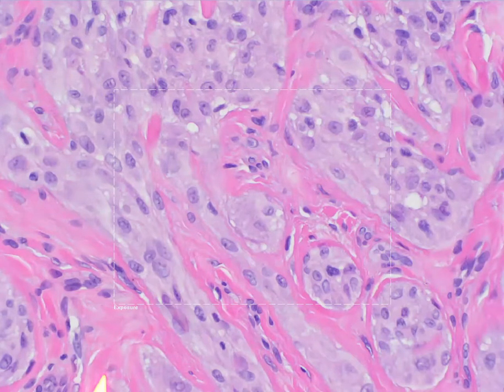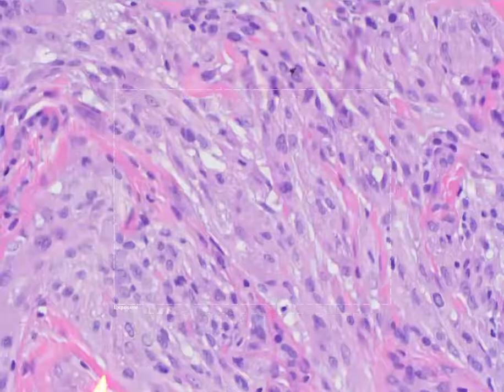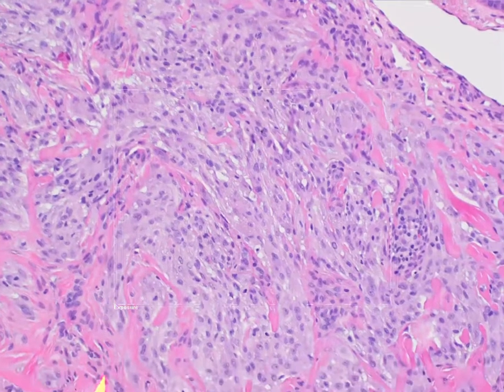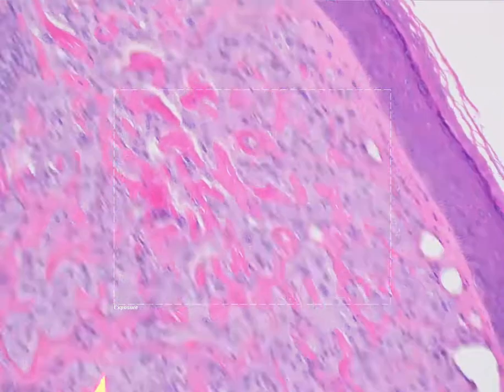Now, in terms of the staining pattern, this tumor is typically positive for NKI-C3, for PGP9.5, for MITF, and for neuron-specific enolase. It can be S100 positive, but S100 positivity tends to be quite focal and weak. So that's something to pay attention to, is that S100 may not be the most reliable marker for this neoplasm. So this is a neurothekeoma, and this is the cellular variant of a neurothekeoma.